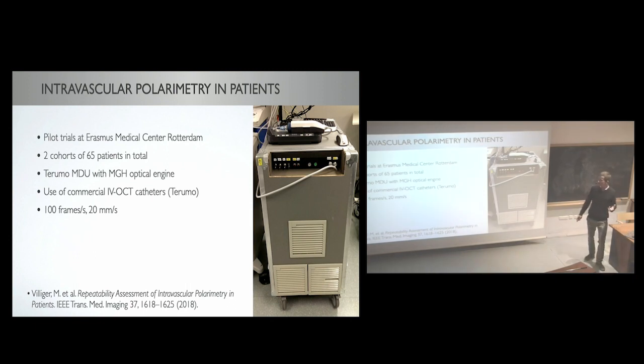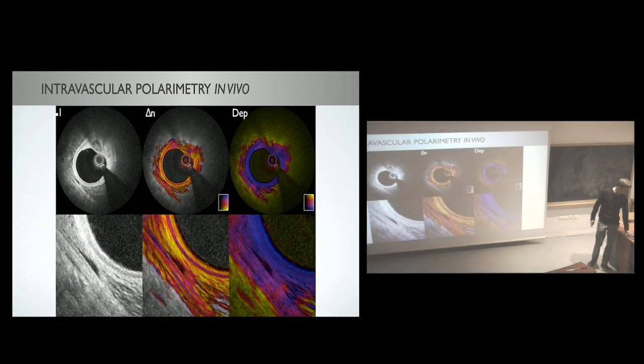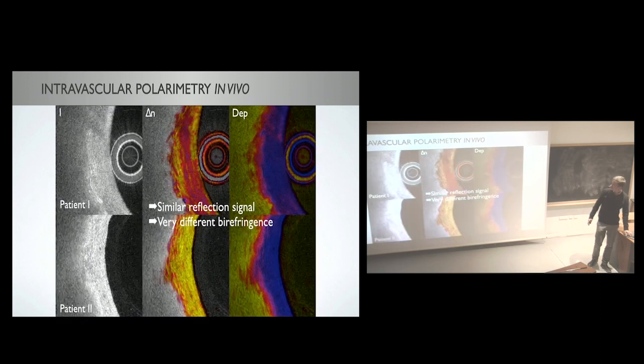Because this is compatible with commercial catheters, this facilitated the translation. So we built a custom OCT console here, but interfaced it with commercial catheters, which allowed us to relatively easily perform studies in human patients. And I want to slowly speed up a little bit.